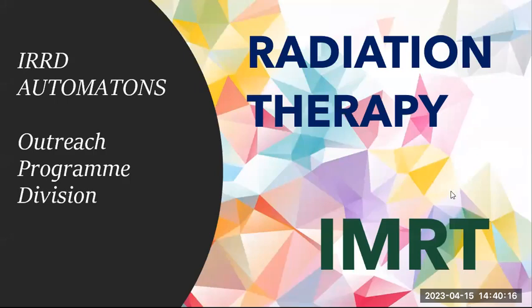The intensity modulated radiation therapy. So last class we have seen the different steps like immobilization, acquiring of images using different modalities, converting the images into a 3D volume, and volume planning and dose planning. These are the steps we have seen in the last class.